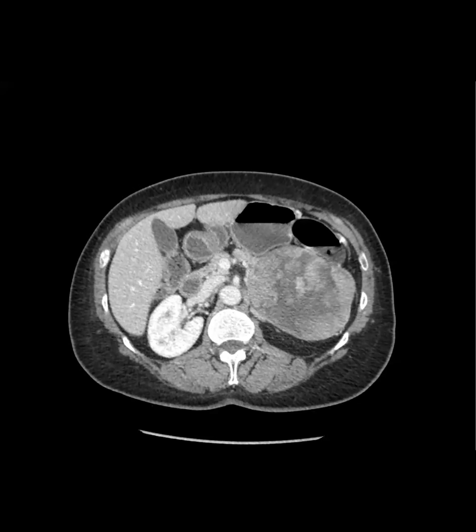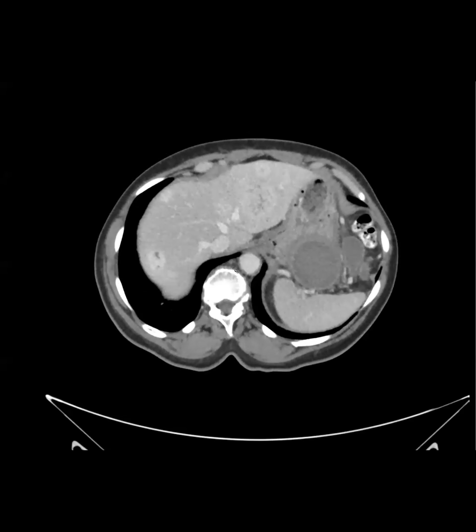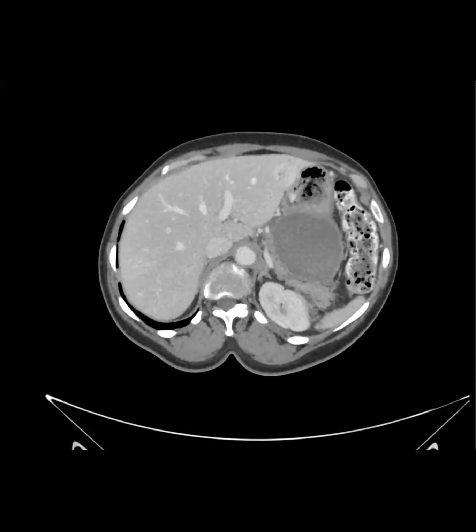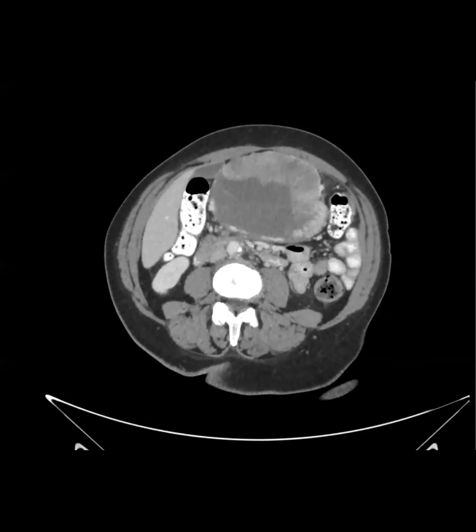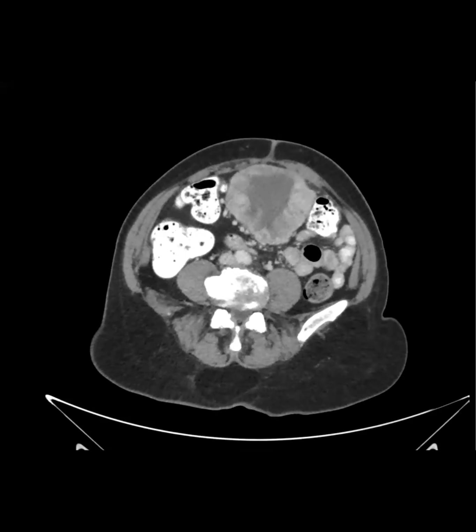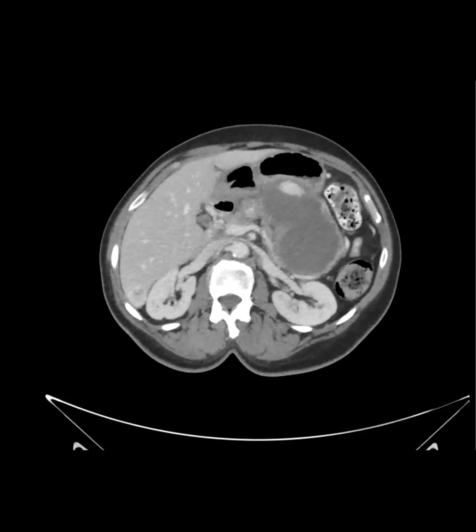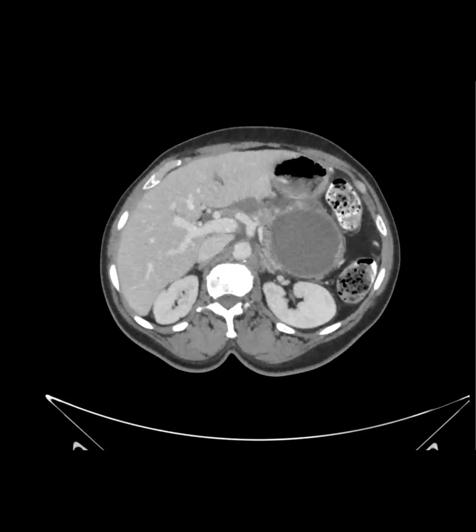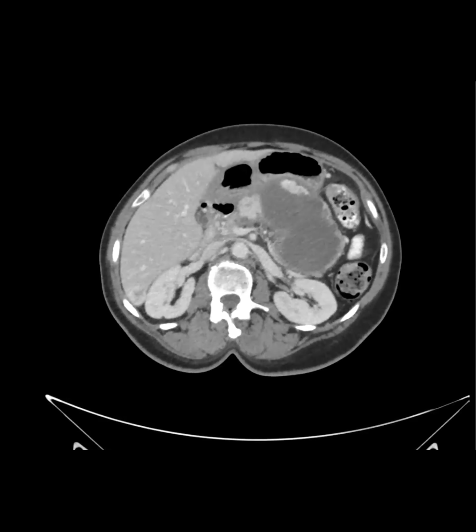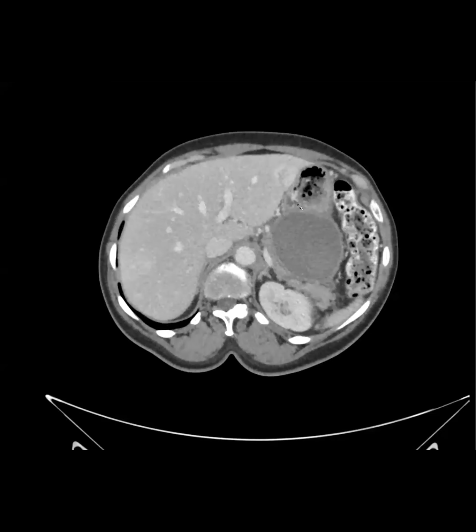I'm going to show you a companion case. So this is my companion case. This one also has liver lesions. Ignore the liver for now and just look at the mass. Cystic neuroendocrine tumor. Okay, so this one is also solid cystic, and the pancreas is there, smushed, but maybe it's affiliated with the pancreas, and it could also be affiliated with the stomach.